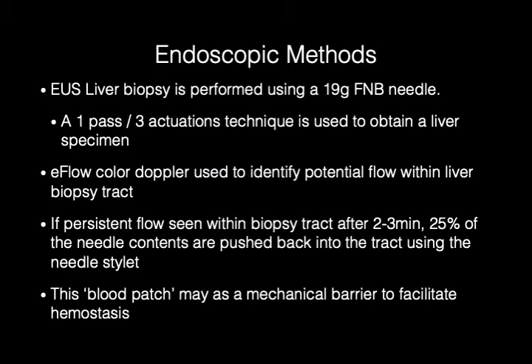EUS liver biopsy is performed using a 19-gauge FNB needle. A one-pass, three-actuations technique is used to obtain a liver specimen. E-flow color Doppler is used to identify potential flow within the liver biopsy tract. If persistent flow is seen within the biopsy tract after two to three minutes, 25% of the needle contents are pushed back into the tract using the needle stylet. This blood patch may act as a mechanical barrier to facilitate hemostasis.